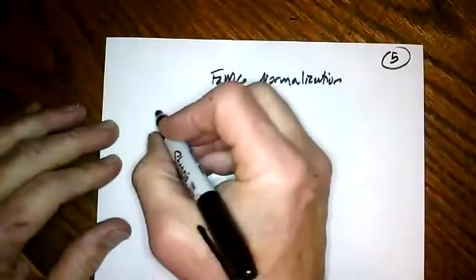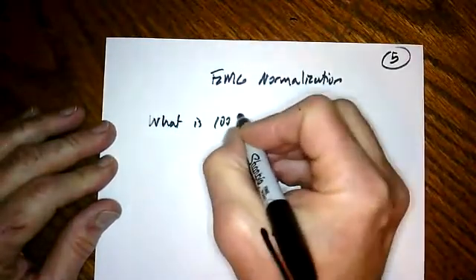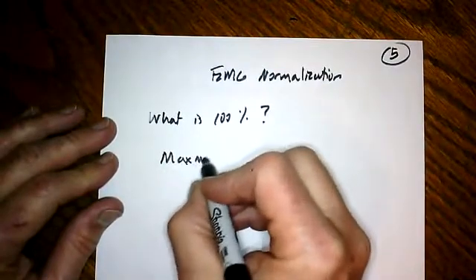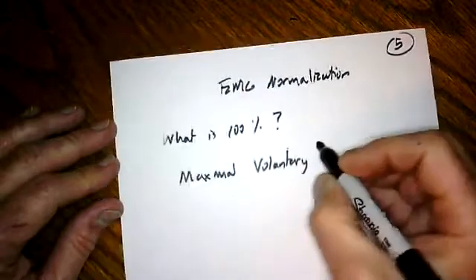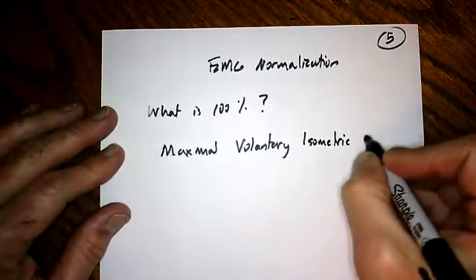But knowing what 100% EMG activity is really tricky. A very common way to first figure out what is 100% is to use a maximal voluntary, as opposed to an imposed, isometric contraction.